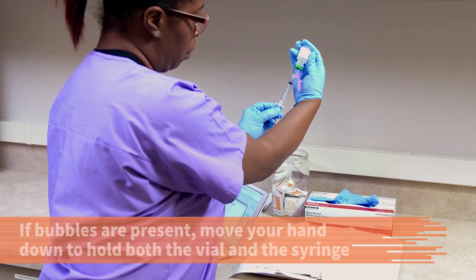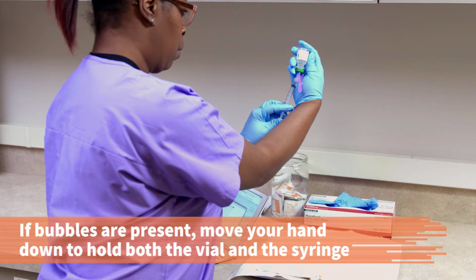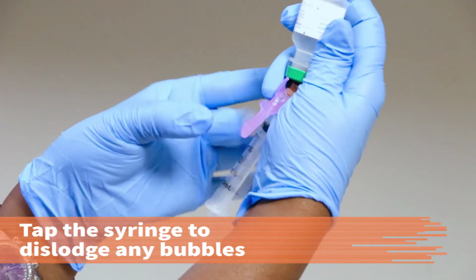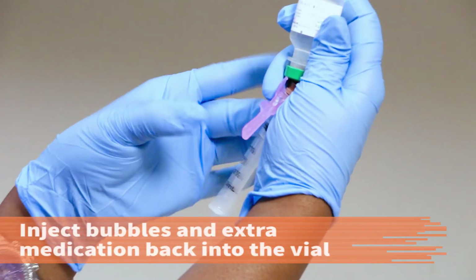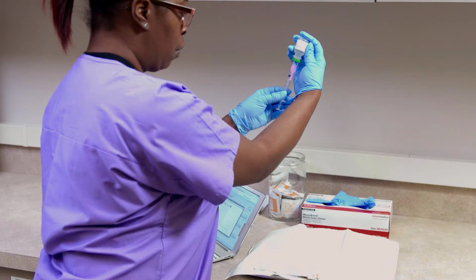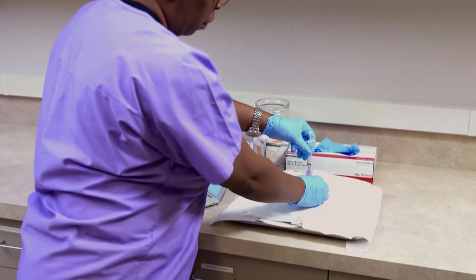If air bubbles are present, move the fingers holding the vial down to grasp the vial and syringe as a single unit. With your dominant hand now free, use it to tap the syringe until the air bubbles dislodge and float into the tip of the syringe. Inject the air bubbles back into the vial with the extra medication that was withdrawn. At eye level, make sure the accurate amount of medication is in the syringe unit.